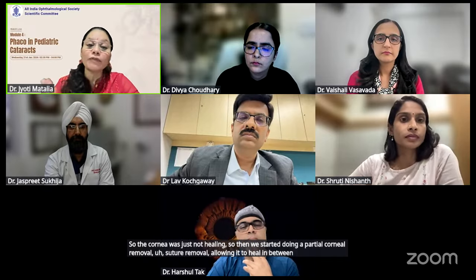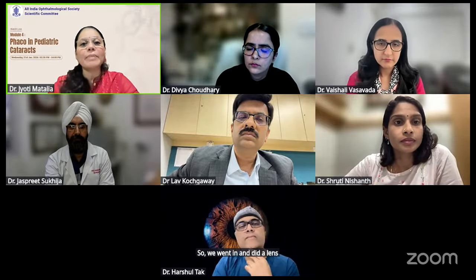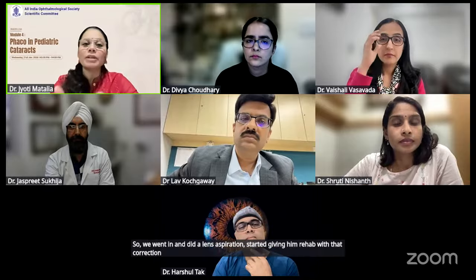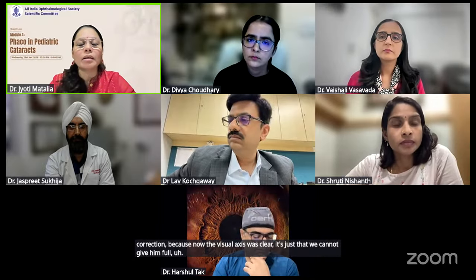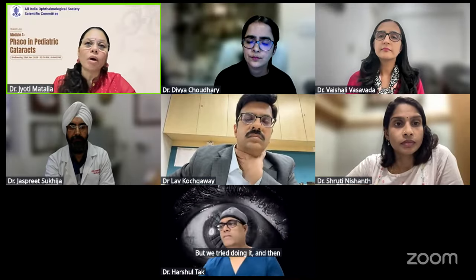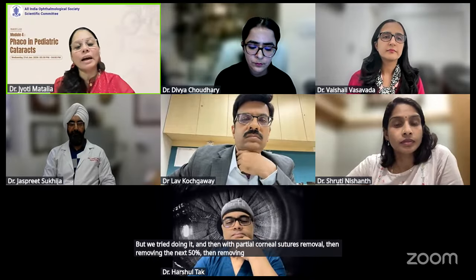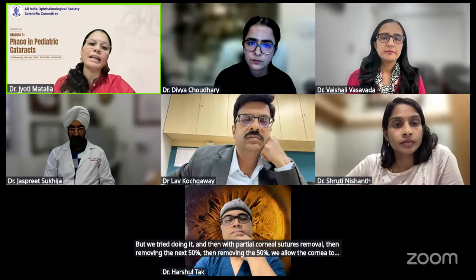And then we realized it was taking 4 or 5 months. So we went in and did a lens aspiration and started giving him rehab with that correction, because now the visual axis was clear. It's just that we cannot give him a full perfect refractive error. But we tried, with partial corneal suture removal, then removing the next 50%, then the remaining 50%, allowing the cornea to heal, and then finally went in with an IOL.